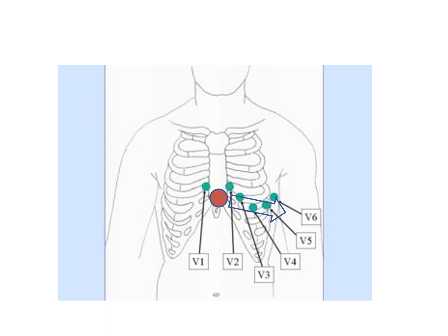So if you look at this diagram, you will see that lead V1 is going to be positive if the electricity is going from the AV node right, up, and towards the sternum, towards the front of the chest wall. Lead V2 will be left, up, and again towards the sternum, towards the chest wall.